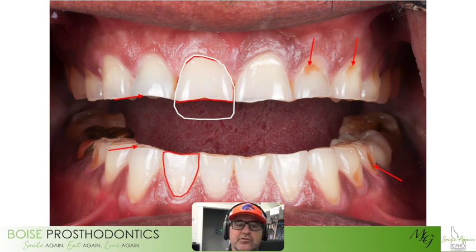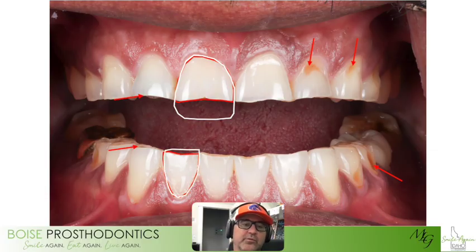And then you'll see in the lower jaw, if that canine is the right height of where the teeth need to be, we can only really increase the length of the anterior or the worn dentition a little bit. So it helps me figure out how we are going to do that. Fun process. I love doing this.